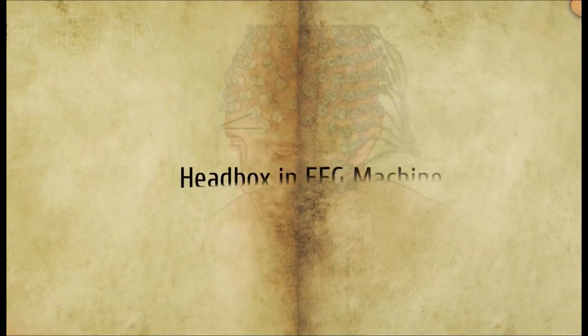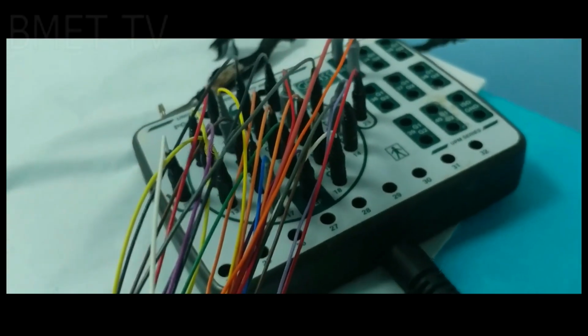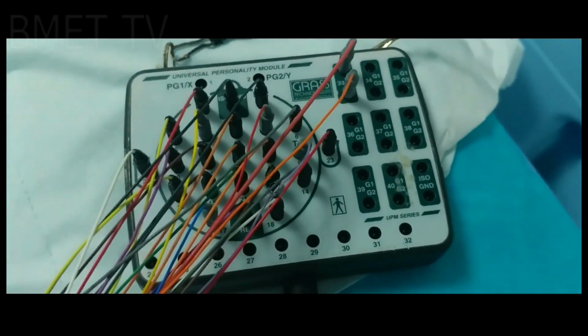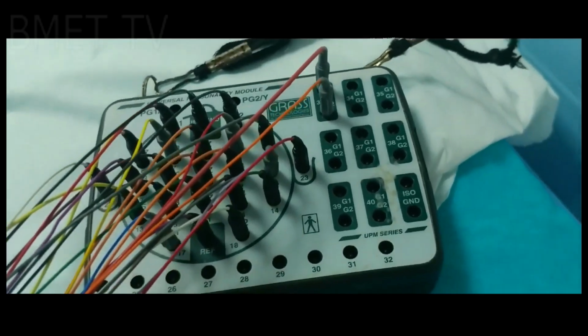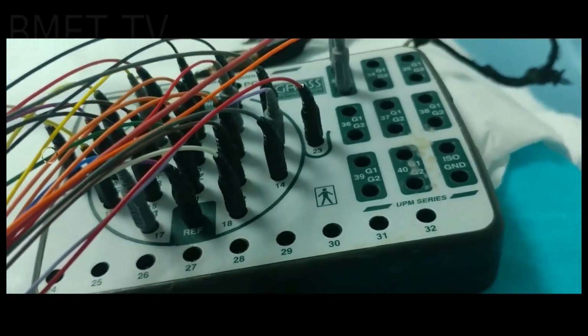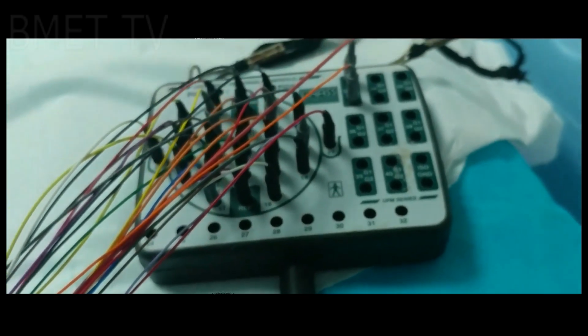Let's begin with Headbox in EEG machines. Your EEG leads will be put on by the EEG technologists. They will apply and remove wires, and also test the system to make sure that everything is working. When the leads are on your scalp, they will then be connected to a small portable recording unit called the Headbox. This sends information about your brainwaves to larger units on the wall using a connecting cord.